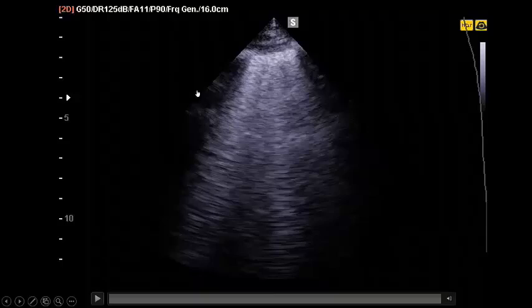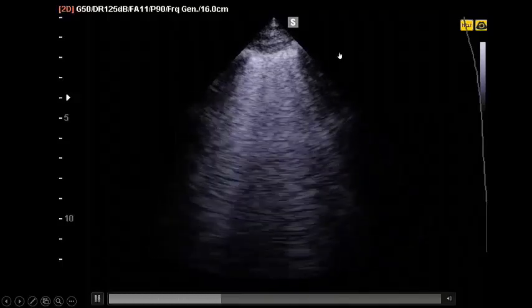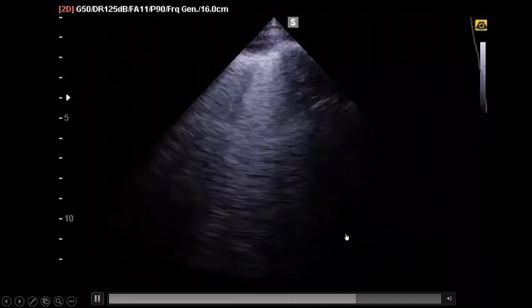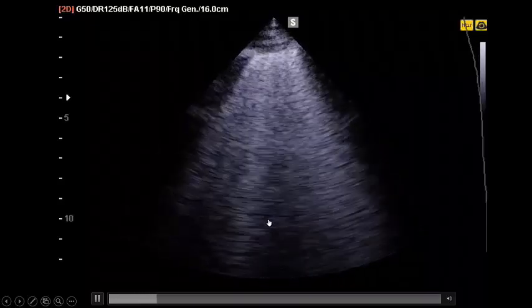Third, lung. It is advanced critical ultrasound. We survey our patient with lung ultrasound. Almost in all areas of our patient, there are these pictures.